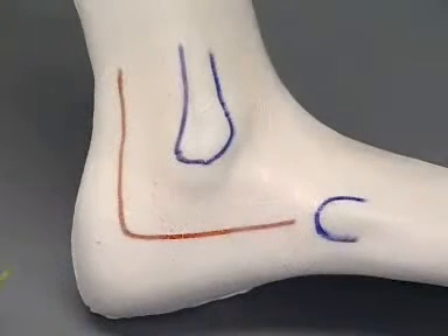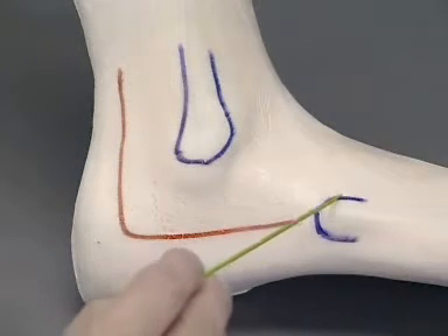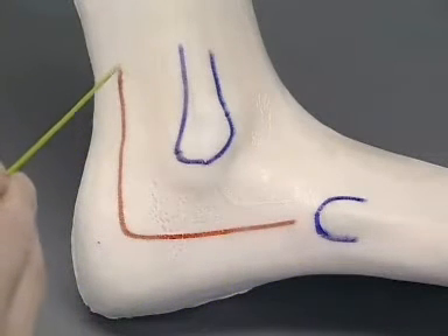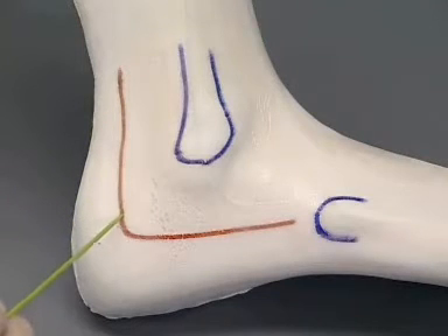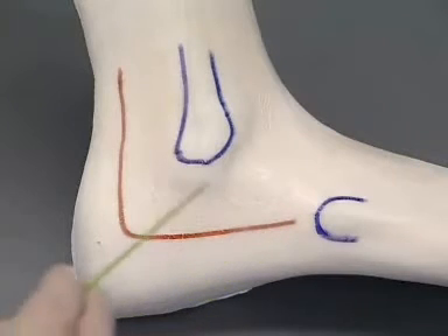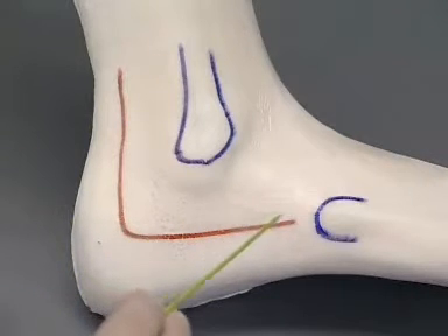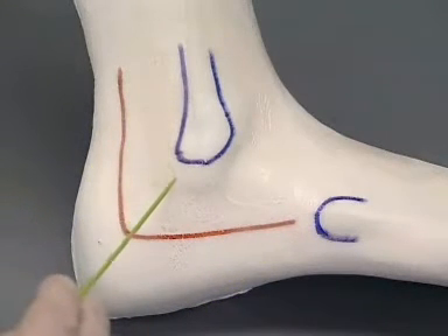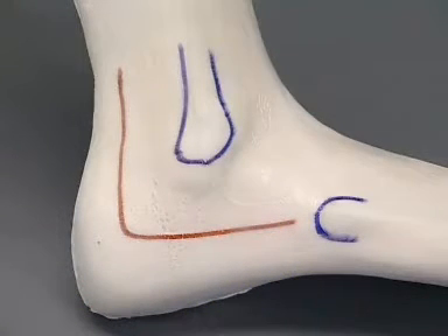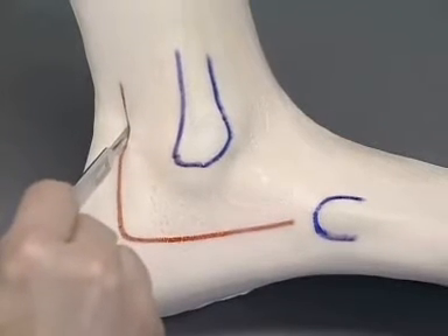On the foam model, the lateral malleolus and the base of the fifth metatarsal are palpated and marked. The extended lateral incision runs vertically close to the Achilles tendon and turns distally at the level of the base of the fifth metatarsal. Distally, care is taken to avoid the peroneal tendons.